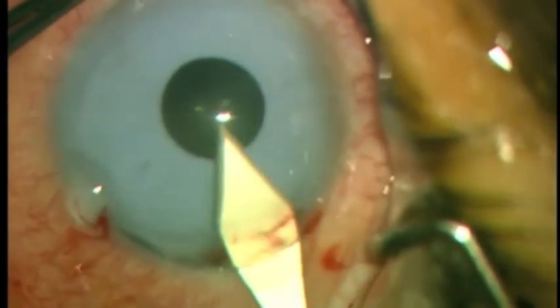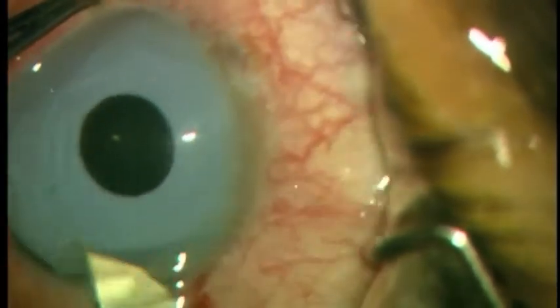Second, a keratome is placed into the anterior chamber and the incision is enlarged.